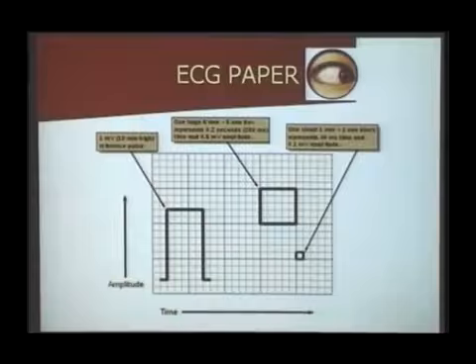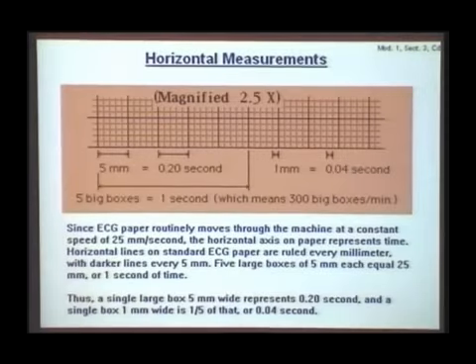Only then is whatever I am going to say subsequently going to be correct. Only when this ECG is recorded in this way, whatever I am going to say is going to be correct. Whether you see ECG to diagnose myocardial infarctions, ventricular hypertrophy, chamber enlargement, at least see ECG to check your eyesight. If you are not seeing the small and big squares correctly, see the ophthalmologist. At least for that purpose, from tomorrow you can see the ECGs. So, check your eyesight. You must have good eyesight to look at the small squares and the big squares.